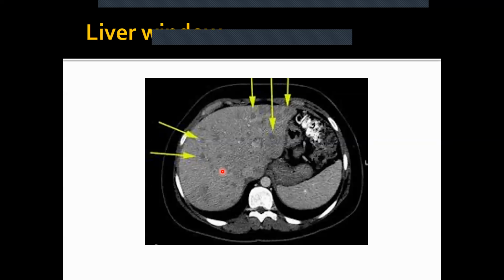In terms of color, similar to how if you raise the lighting on your phone camera, if you put it too dark, you're not going to be able to see anything because everything will turn black. If you turn it all the way up, everything's going to look really bleached out, and so you aren't going to be able to see anything then. So what you want to do is set it based on the lighting of the setting you're in. Windows are the same thing.